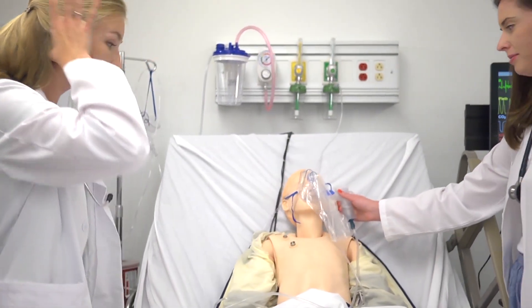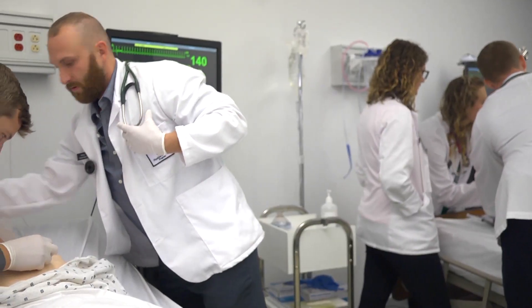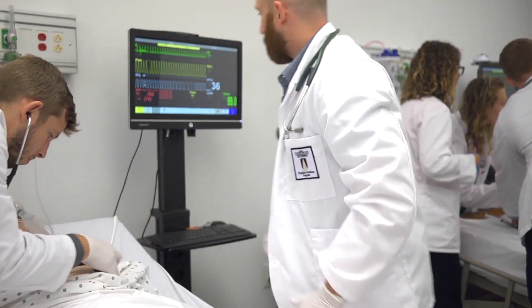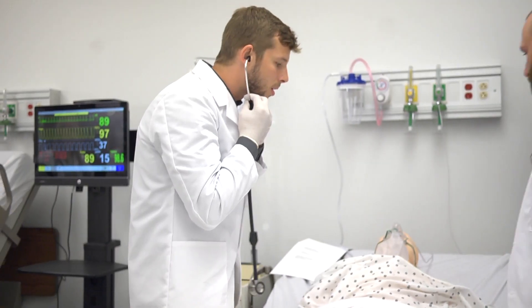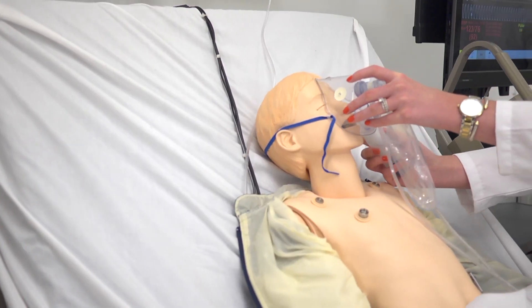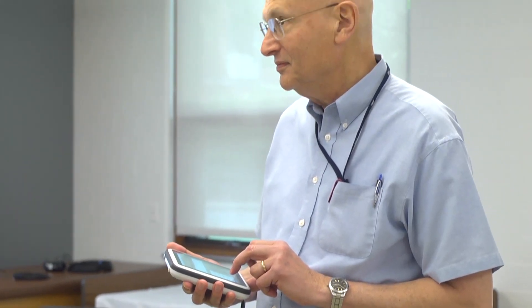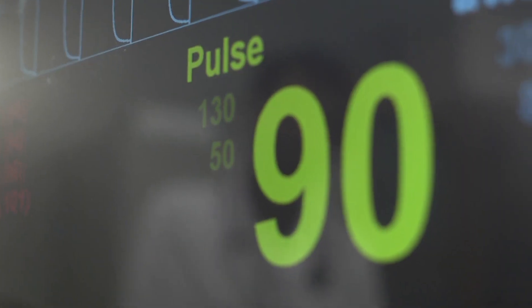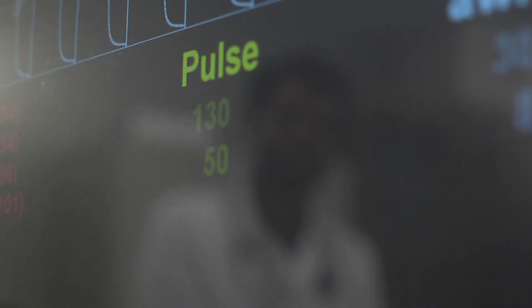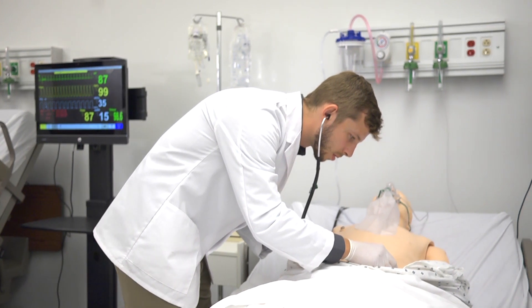We have high fidelity simulators, which means the simulators are capable of being programmed with different cases. We can get the mannequins to speak, and we can change all of their vital signs independently — their heart sounds, lung sounds, abdominal sounds — and we can spontaneously introduce perturbations in the patient's health as well.